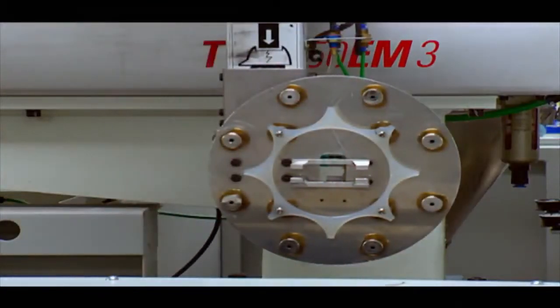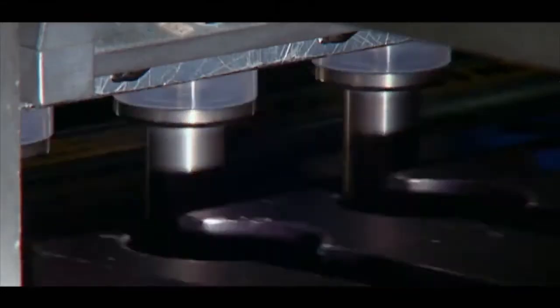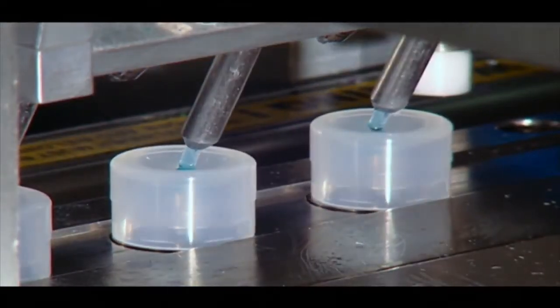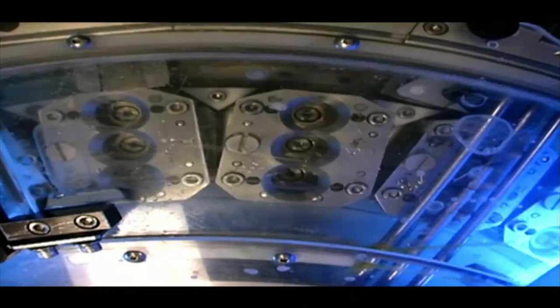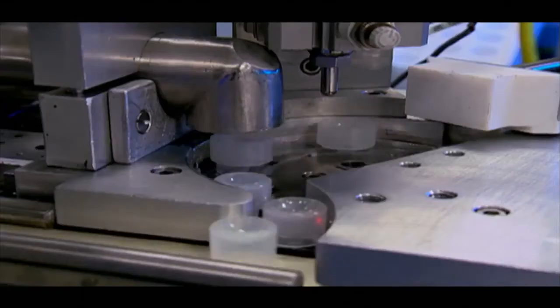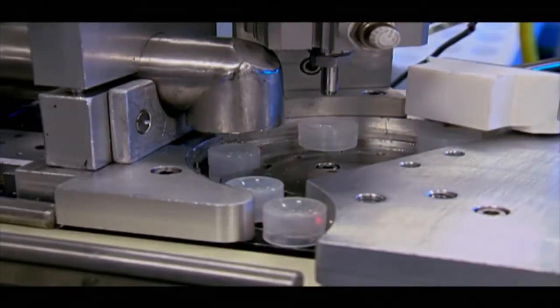This is the secret behind the durable contact lens, a simple two-part mold. Hundreds of molds are continuously fed into a machine that injects a few drops of liquid acrylic in between the two parts. A casting machine moves the injected molds through a UV scanner that triggers the polymer chain reaction that turns the liquid into a lens. Each mold is individually made to prescription.